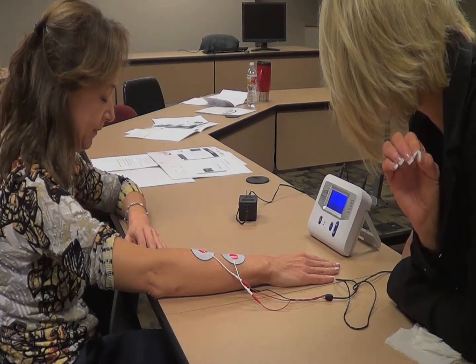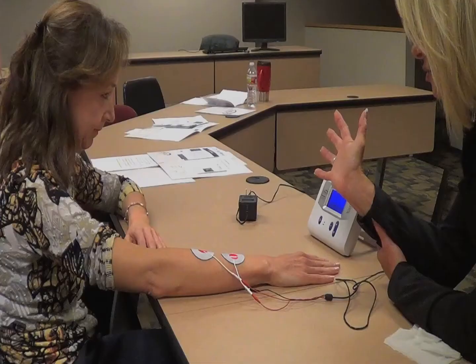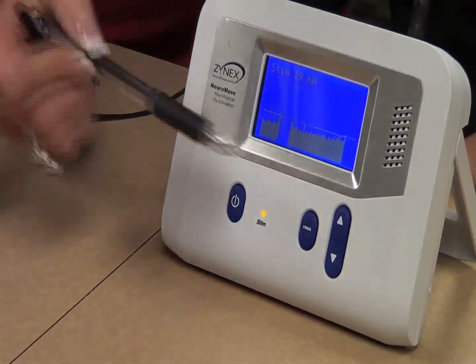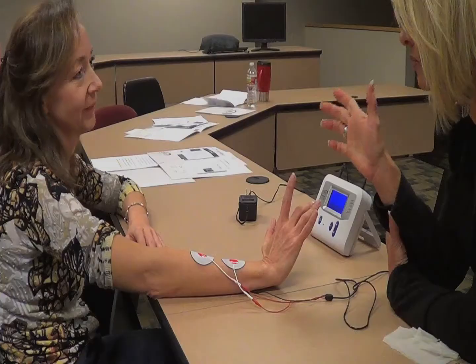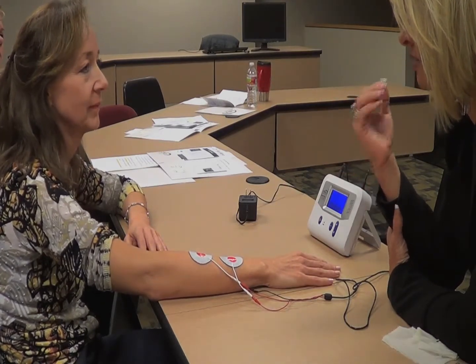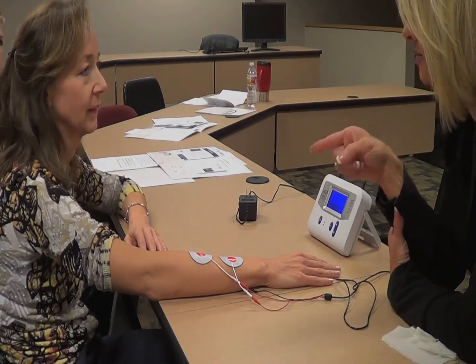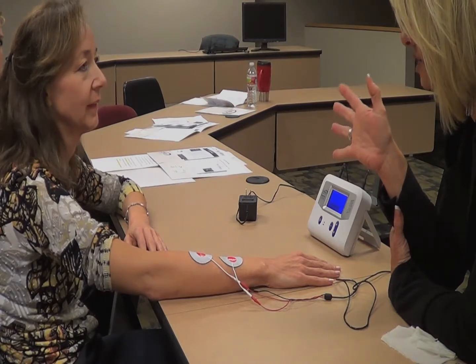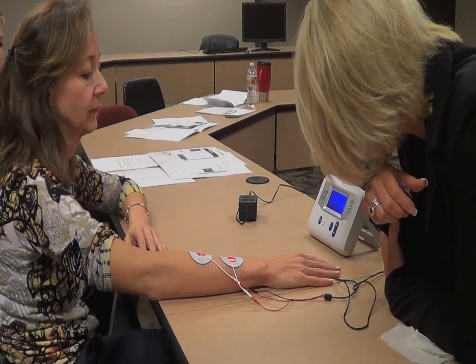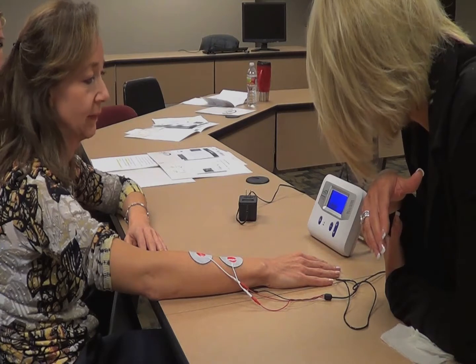Okay, open your eyes and look at that visual on the screen. And imagine that this is the rock, and I want you to be reaching up and grabbing the rock, okay? Good. Good job. Sometimes that is what will make a patient go over the edge. It's just seeing something in front of them. Sometimes it's easy for a patient to visualize something, sometimes it's not, and sometimes they just need a little visualization to be able to put them over the edge. So you came way down here, so that's good. You must be anti-stress since you passed that first little section.